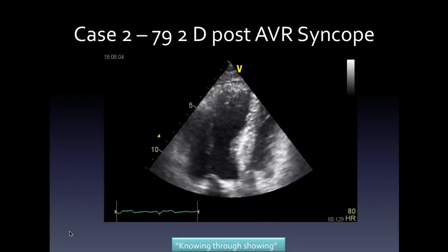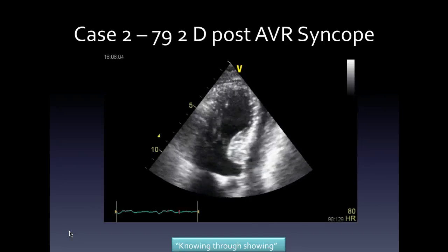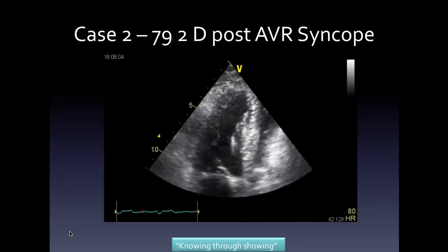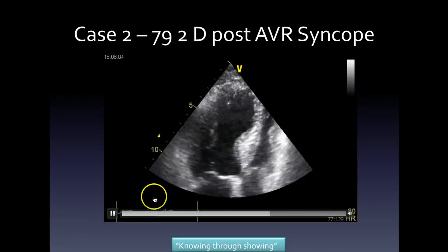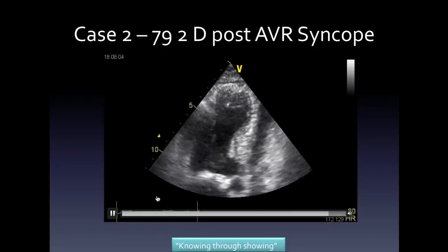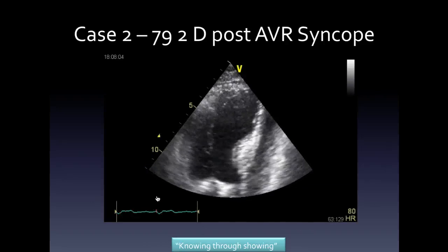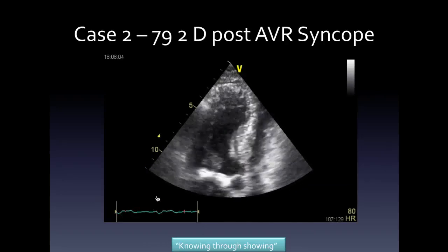Okay, well you're saying nothing because we've only one view, that's a fair point. But it doesn't look like the worst part of it. But do you want to ask me, is this done after an arrest situation? So is he on an inotrope? We don't know, it's not stated. He's not actually. Is there anything odd about how the heart is moving?